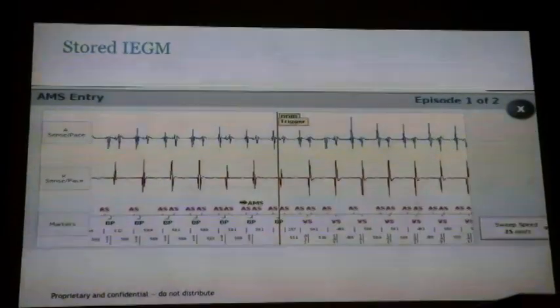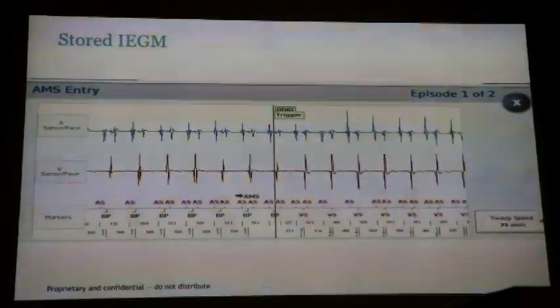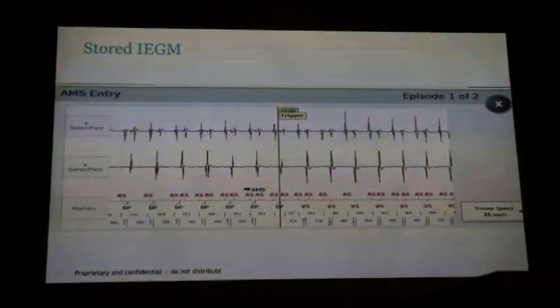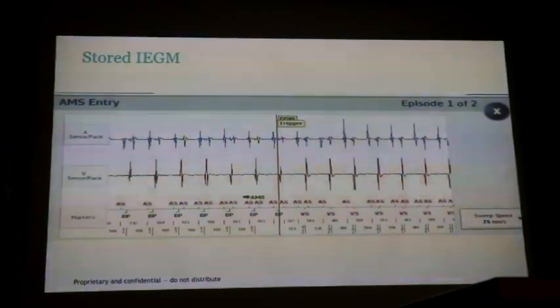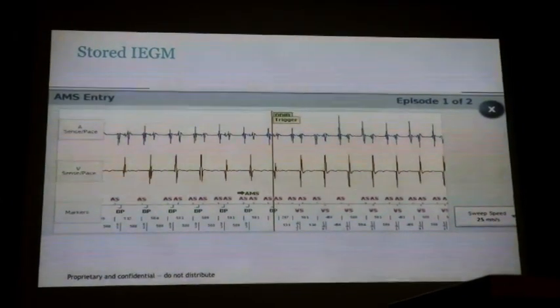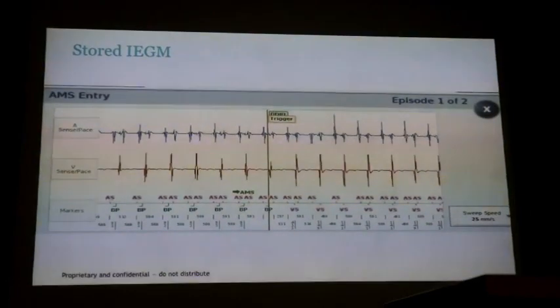Should we check for this while we implant? Absolutely. Yes. Definitely. 100%. I never did. 30 years of experience, never did. So you're checking for the far-field pacing ventricle in the atrial chamber when you are implanting. Definitely.